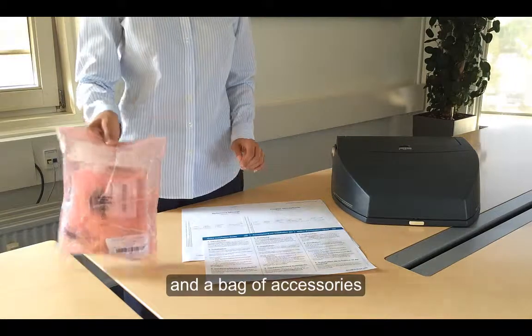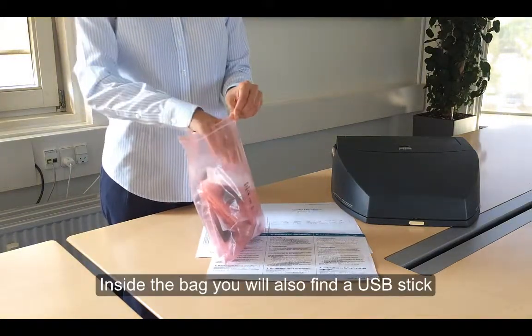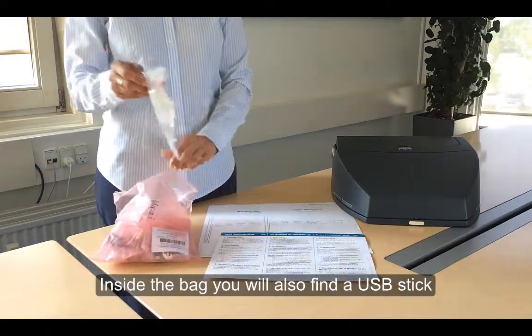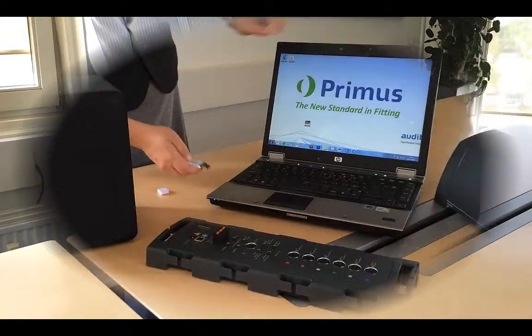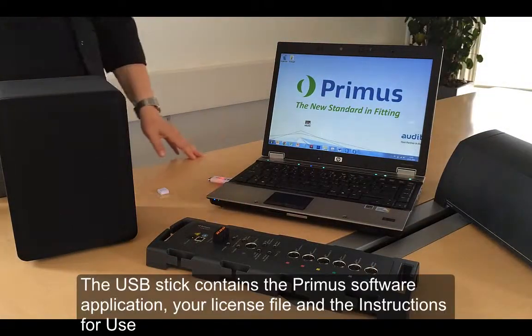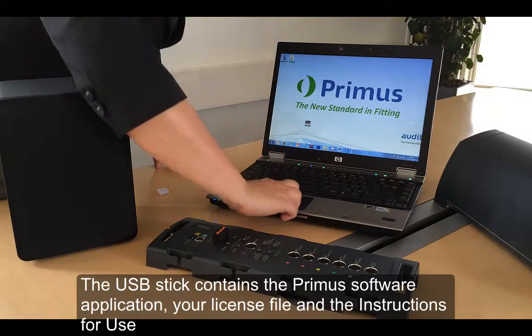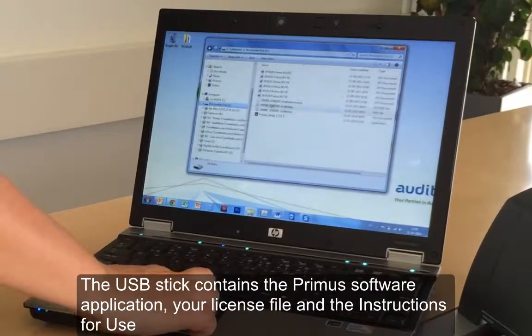All the related accessories such as the USB cable, the couplers and the battery pills will be placed in a small bag. The bag will also contain a USB stick. The USB stick contains your Primus software and license file for the hearing instrument test box. It also has the instructions for use.